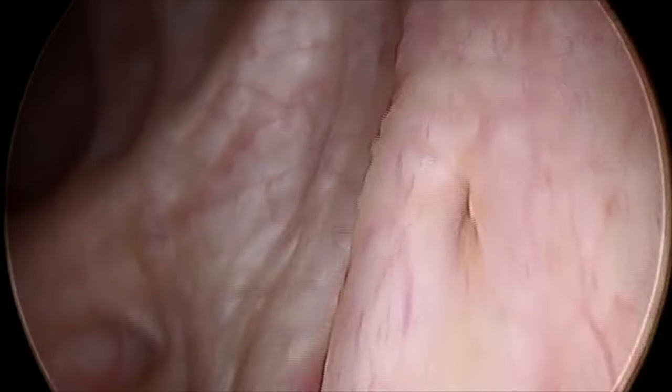You'll also notice the bladder having prominent folds, which are actually muscle fibers. While you might think that this means your bladder is strong, it actually means that the bladder is overworked and in danger of failing. Big biceps, good. Big bladder muscles, bad.